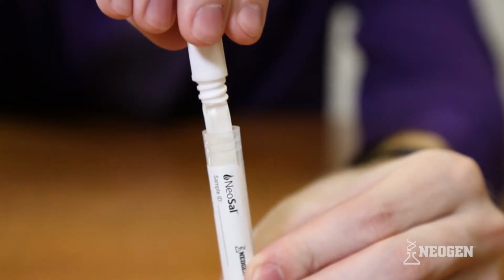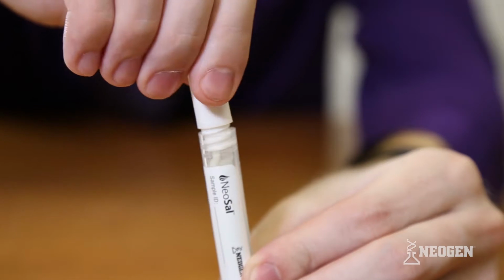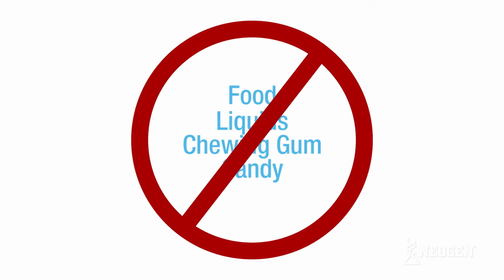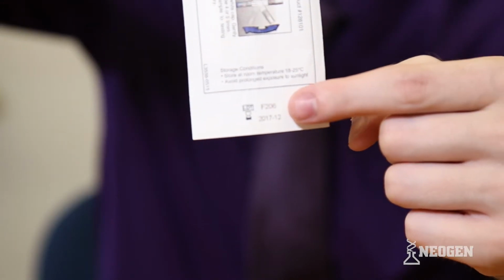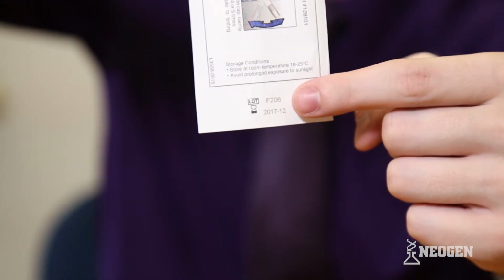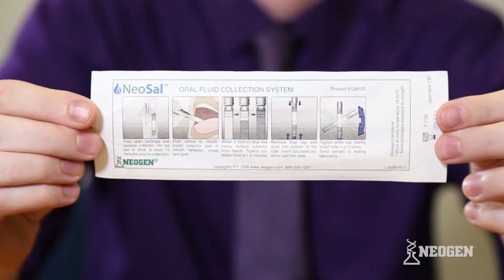Collecting of an oral fluid sample using the NeoSal is completed by following these simple steps. 1. Prior to collection, have a timer available to ensure collection is completed before the maximum collection time of 10 minutes. 2. Ensure the donor has not ingested any food, liquids, chewing gum, or candy at least 15 minutes prior to collection. 3. Explain the collection process to the donor prior to starting the collection. Check the expiration date on the NeoSal device. Follow any additional collection or chain of custody instructions provided to you by the testing laboratory.